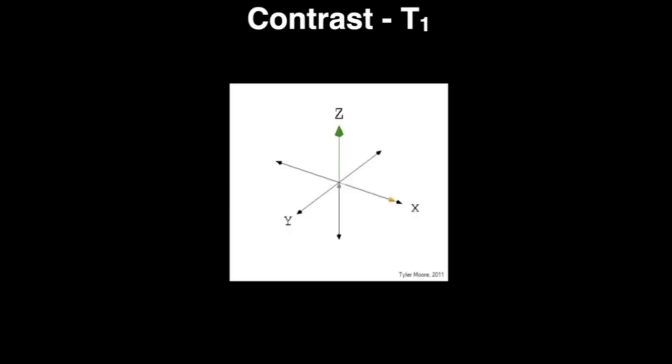That's illustrated here, where the magnetization is this gray arrow, which is almost 0 here. The green arrow is the magnetic field that's applied. You can see as time goes on, that longitudinal magnetization is growing back. Why this is important is that the next time you image that slab of tissue, you have to take whatever magnetization has grown back and excite it again to get your next batch of signal. You can't wait an infinite time, so things don't grow back fully.